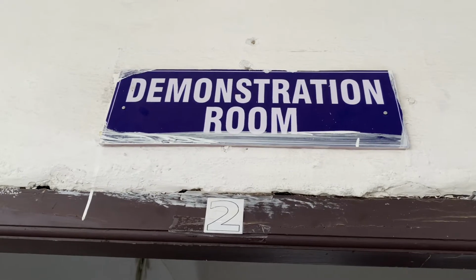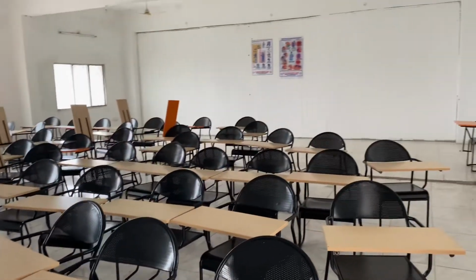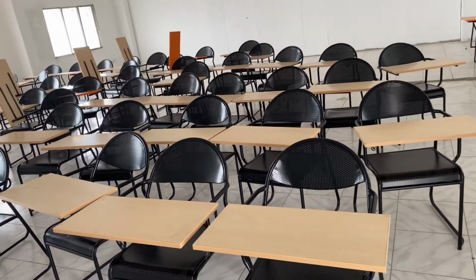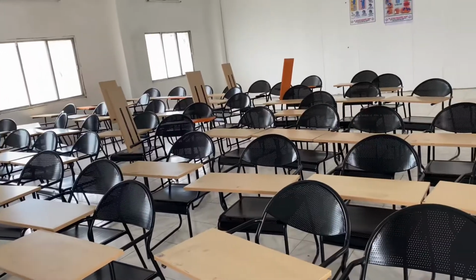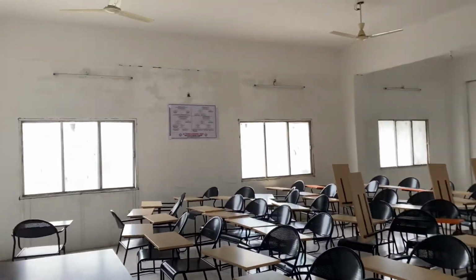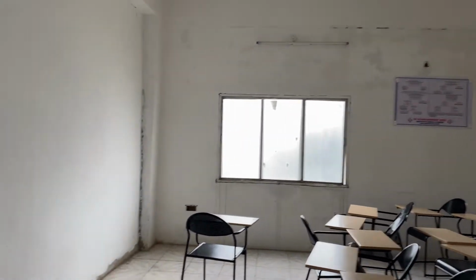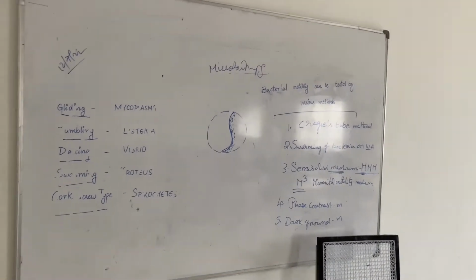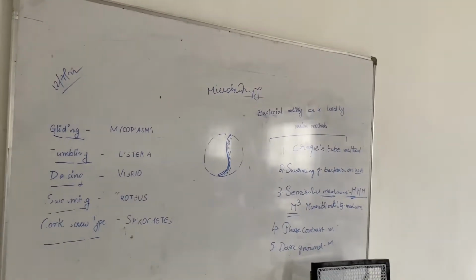And this one is a demonstration room. You see this one, students, they come batch wise, A, B, C, like that. One batch they go to practicals, one batch they come for demonstration, like that. Okay, we divide them. And you see here, board.